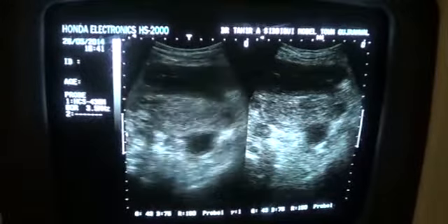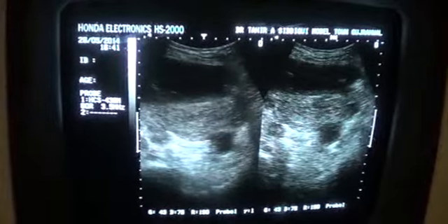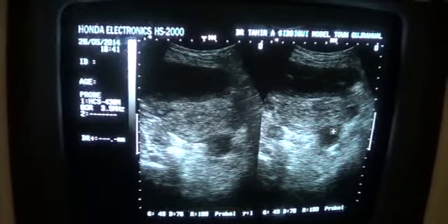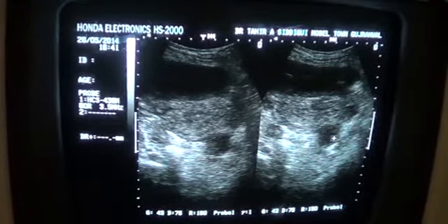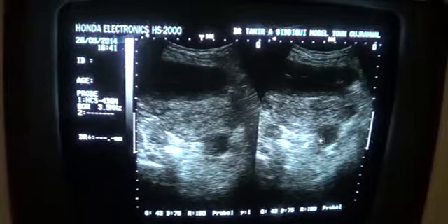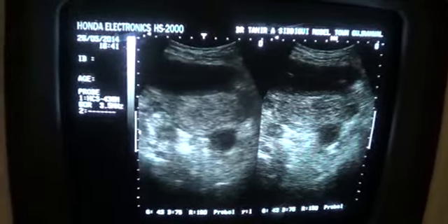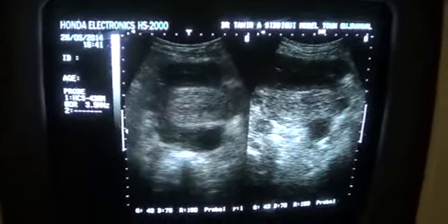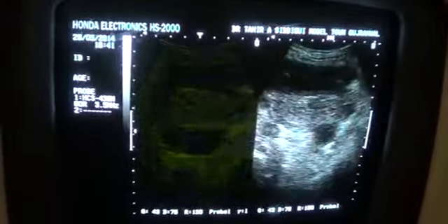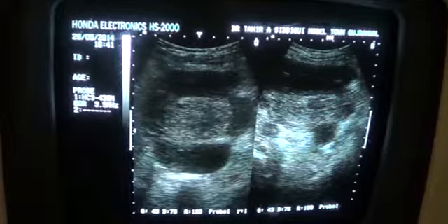Now I am going to tell you one very important thing. This area appears as a cyst, and I also mentioned that this is a follicular cyst. Whenever you see any cystic area, you give it a sweep. A cyst will not change its shape, but in this case, it has changed its shape, has become longitudinal, and there are echoes within it.